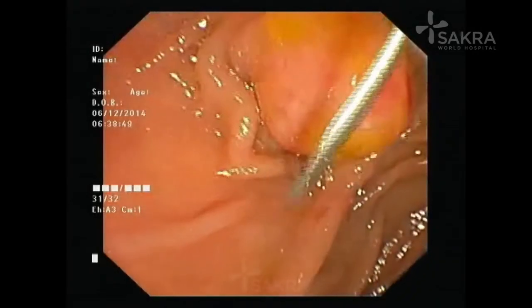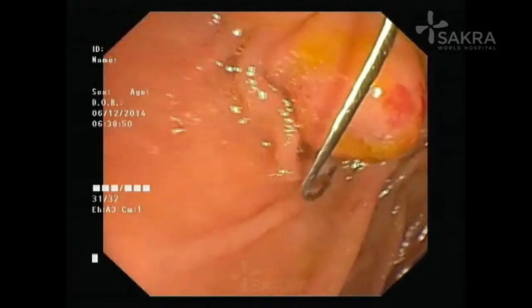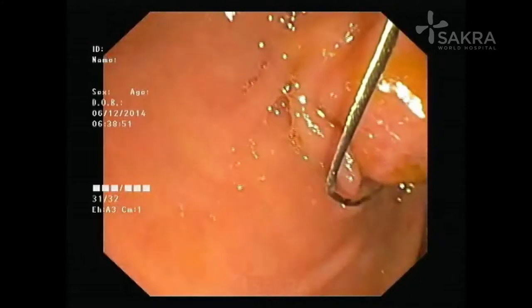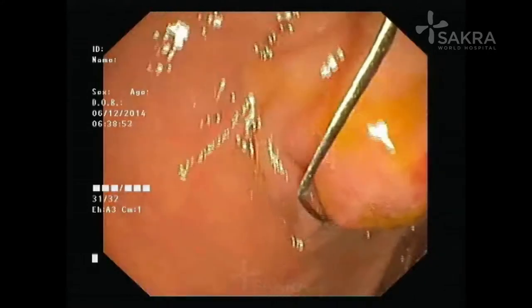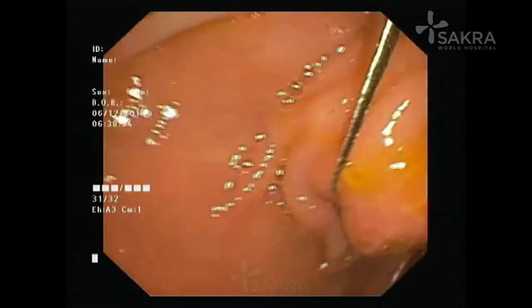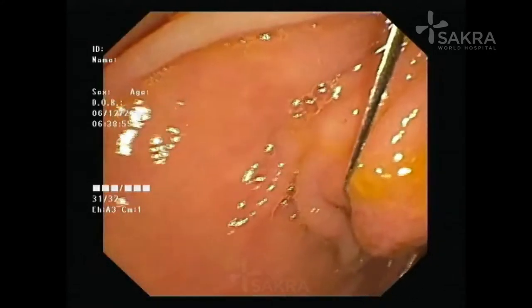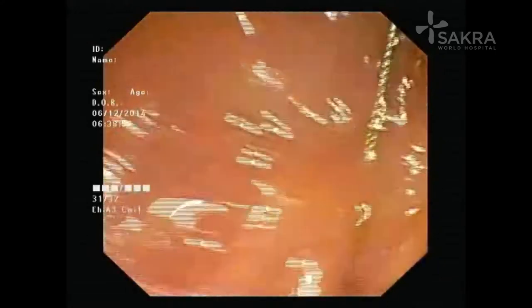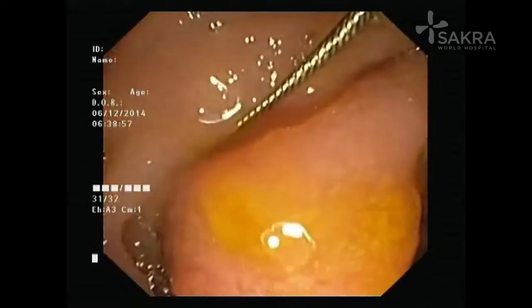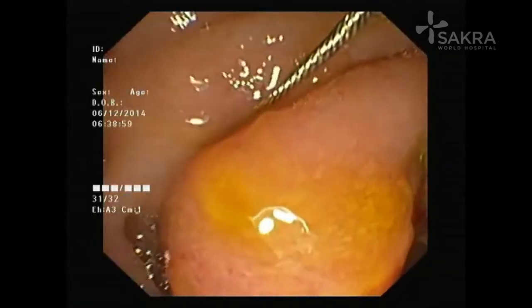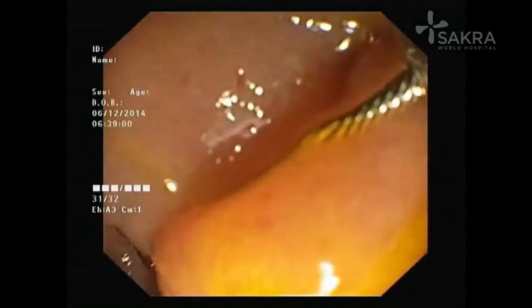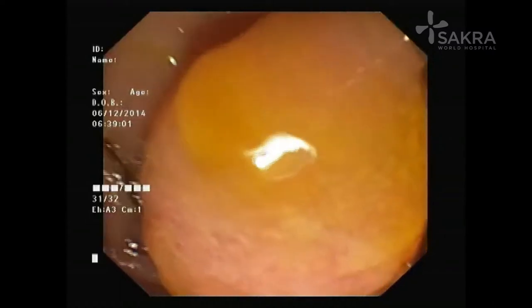This is a patient who had an ampullary adenoma. We initially took a biopsy which confirmed it is a villous adenoma. We also performed an EUS to assess the depth of tumor invasion, which confirmed the tumor was not extending into the bile duct.